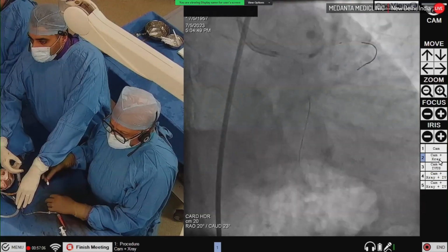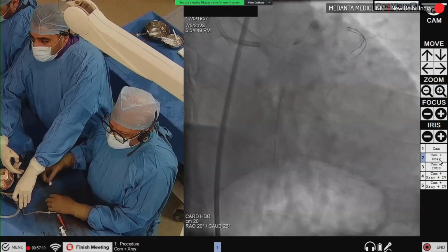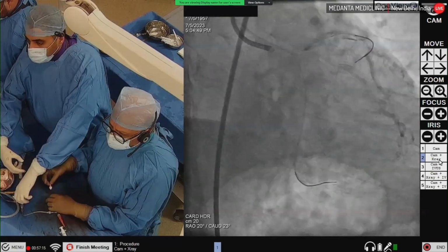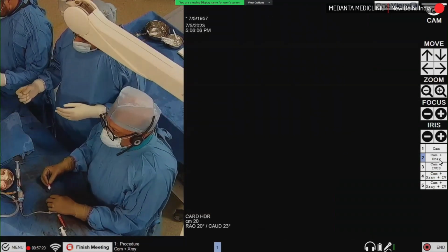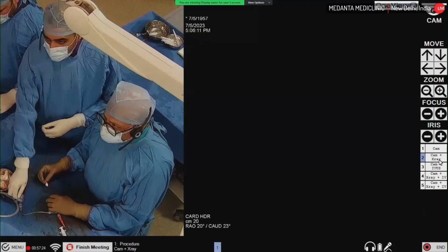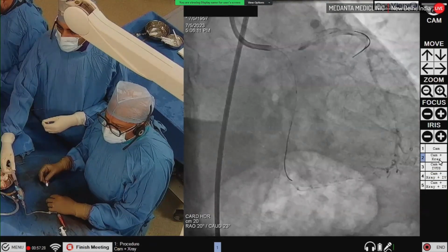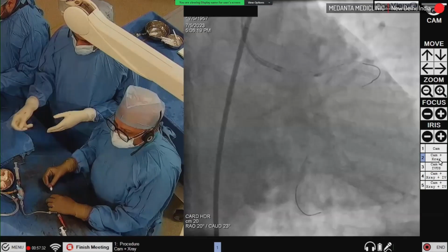We might have to do some changes. Check. Yes. So we have crossed, and it looks a little quite tight. In a smaller branch now, but we can go to a bigger branch. Check, please.